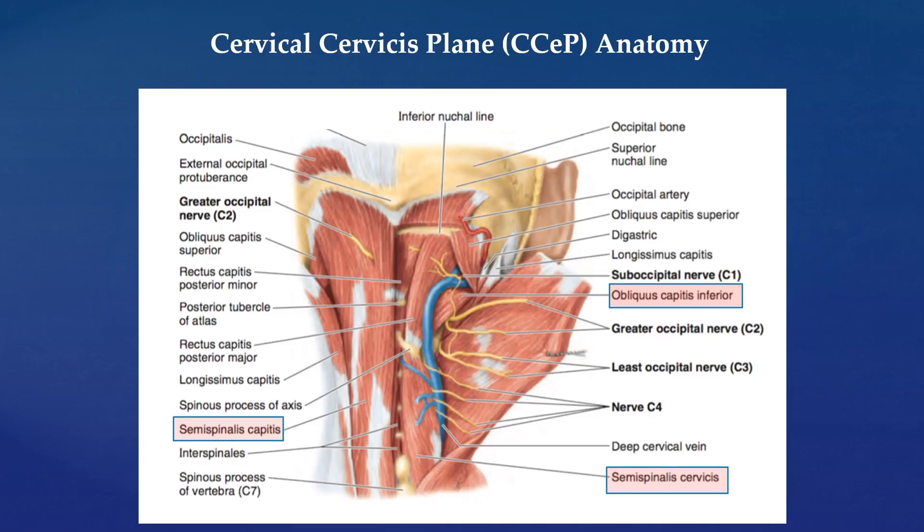The deep cervical vein and artery are located in this fascial plane as well.